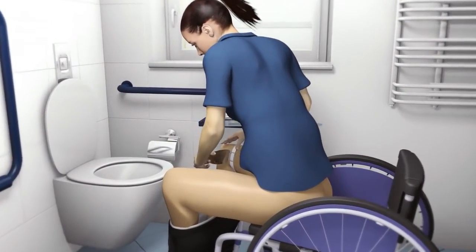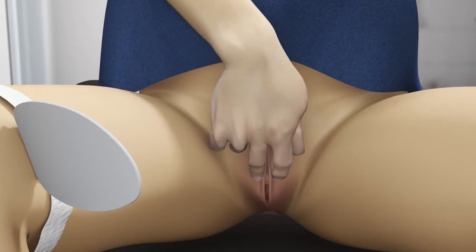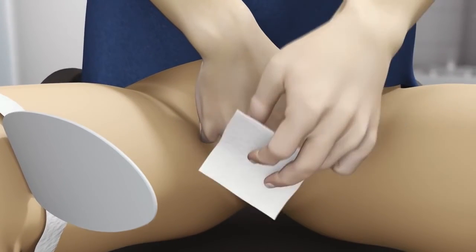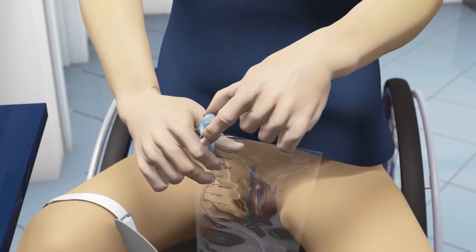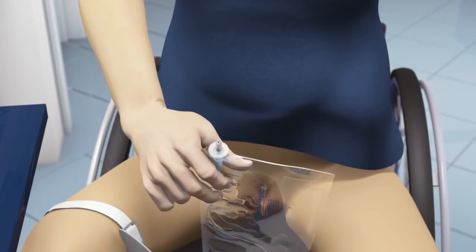If using a mirror, position it so you can easily see the urethral opening. Spread the labia with one hand and use an antiseptic to cleanse the meatus in a front to back direction. Remove the protective cap to expose the introducer tip.